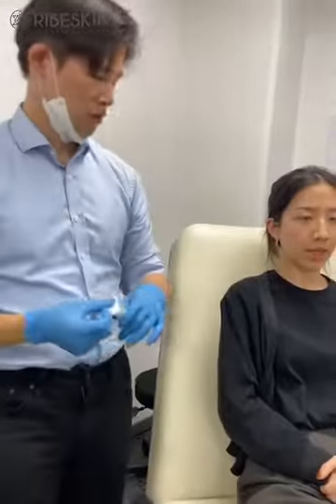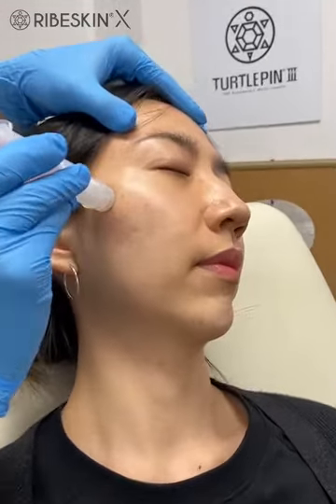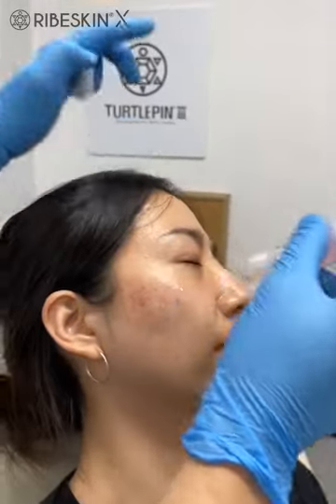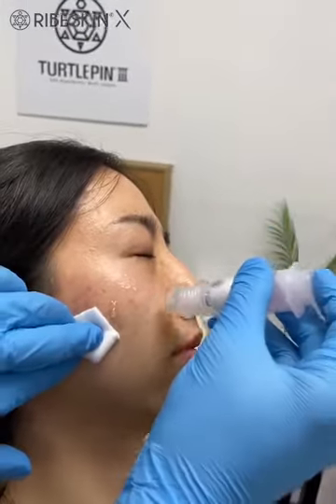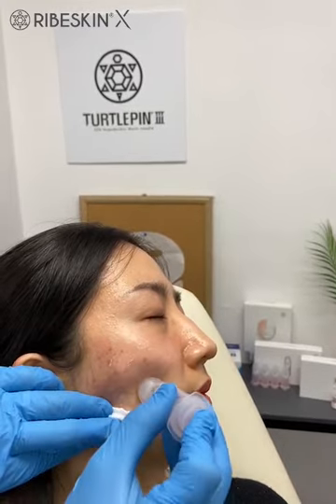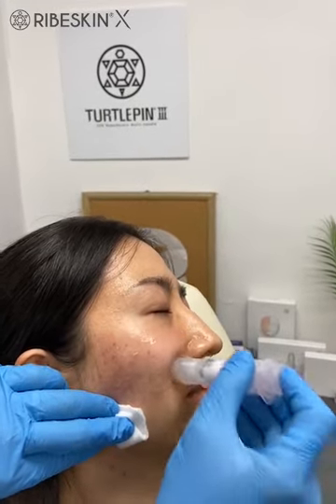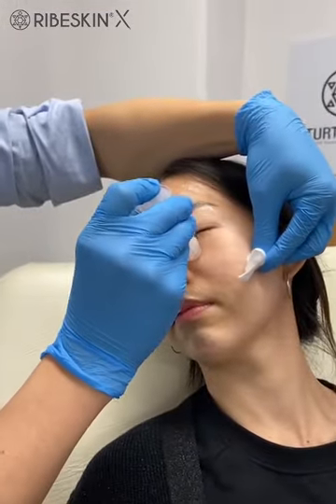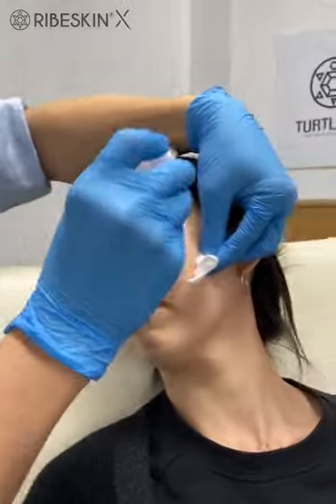How do we inject? Simple. Just stamp it, inject it. Stamp it, inject. Stamp, inject. There could be some leakage, but that doesn't mean it does not penetrate the skin or deliver the drugs. There is just a little spillage. And this kind of spillage also helps the skin absorb the product more effectively. Stamp it, inject it. Stamp it, inject it. Simple — not like it's hard.